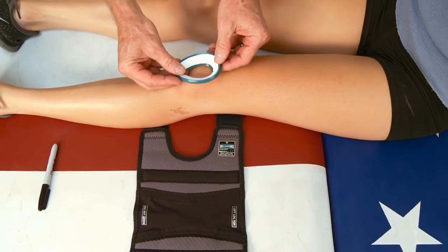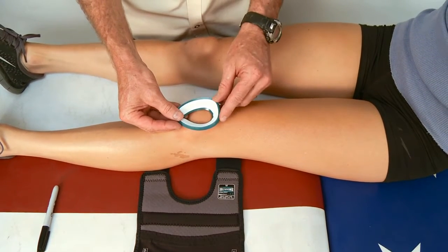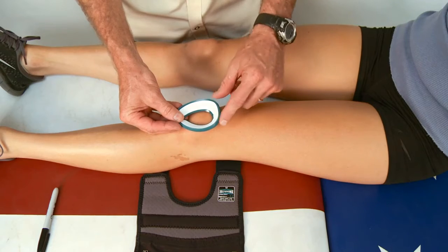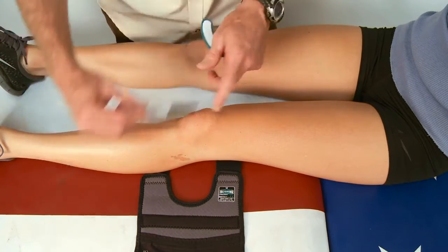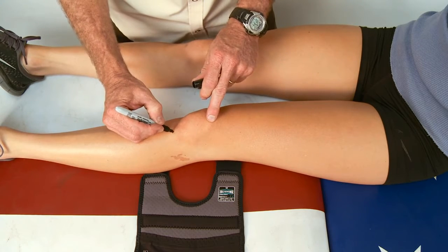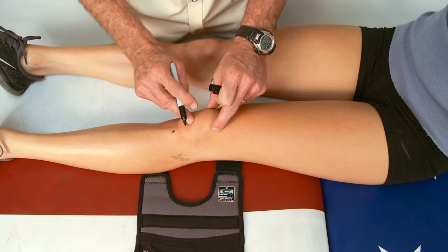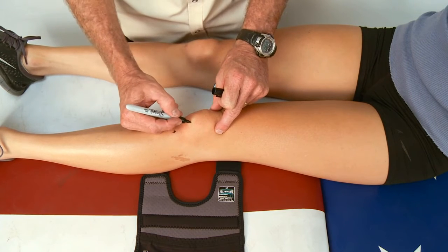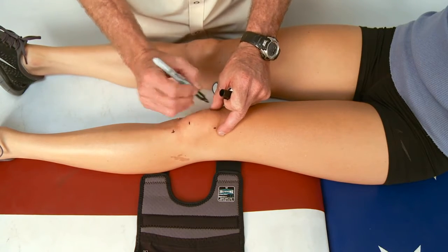When fitting the Shields 2 patellofemoral brace, I tend to start using the buttress as a patella so I can demonstrate to the client which way their patella is moving. So in this case, the buttress is acting like the patella, these being the base points, this is the apex. Once you reference your landmarks, such as the tibia tuberosity, the apex I usually locate by going back and forth on it, finding the bottom portion of the apex, as well as the two base points.